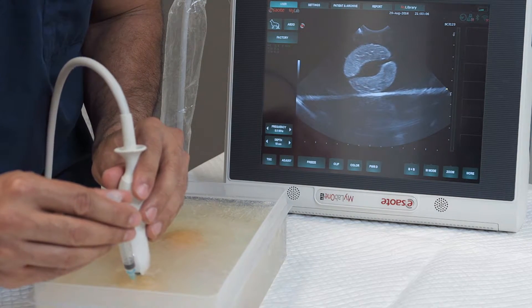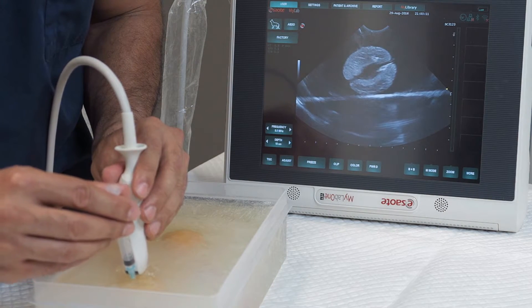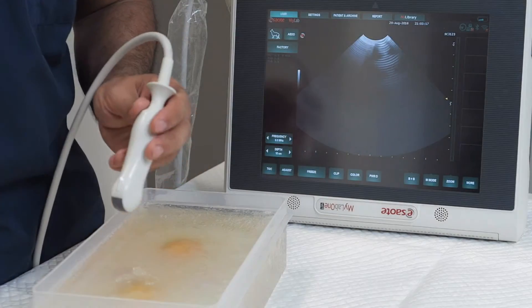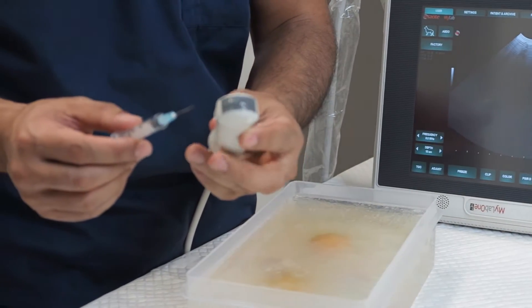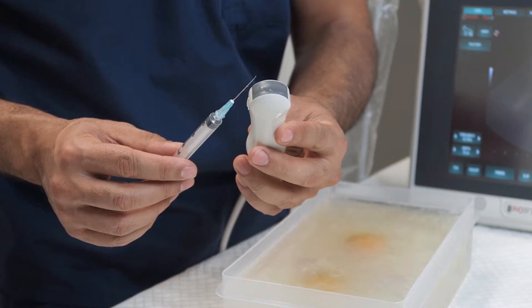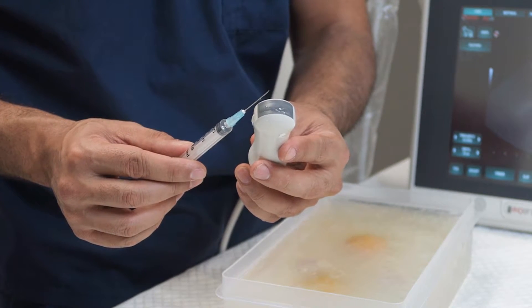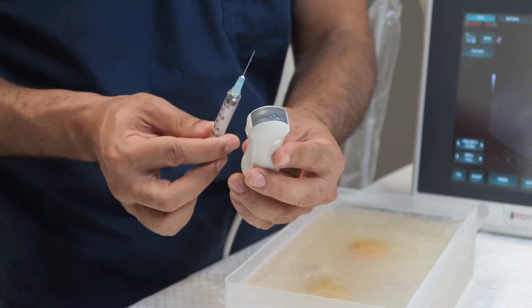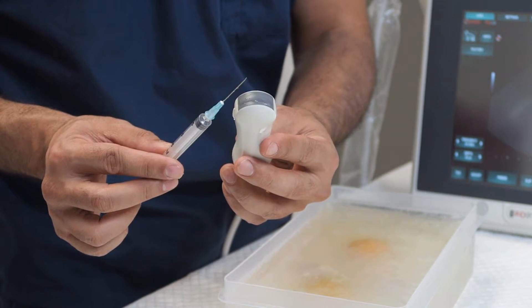In the same plane, we see the entire needle. The second thing is understanding where the needle shows up on the screen. We want to insert the needle into the tissue just in front of the ultrasound probe and aim so that the point of the needle comes into the middle of the ultrasound beam, which is where we want the area of interest to be.